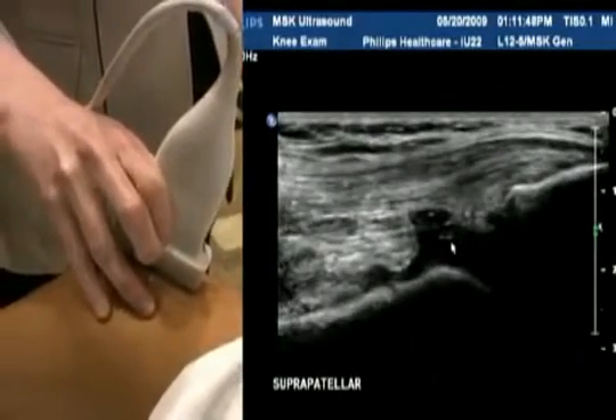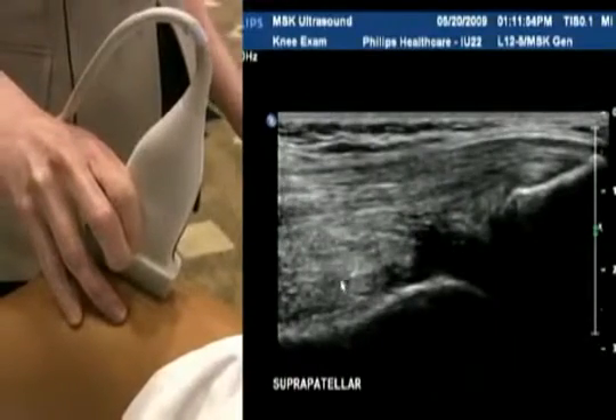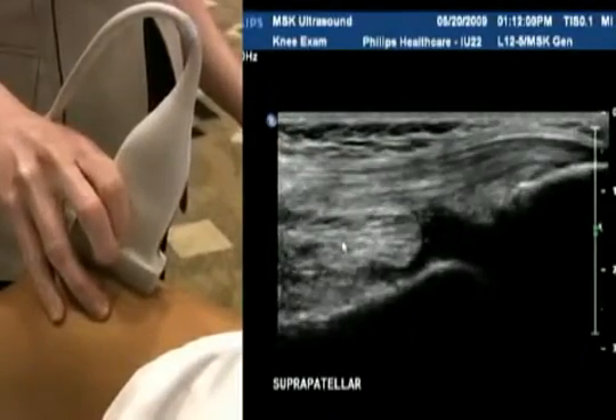Most people have a little bit of fluid. When it gets an excessive amount — say we're starting to get to this level — that would be called a suprapatellar effusion, and that's certainly something that ultrasound can guide a needle to drain.